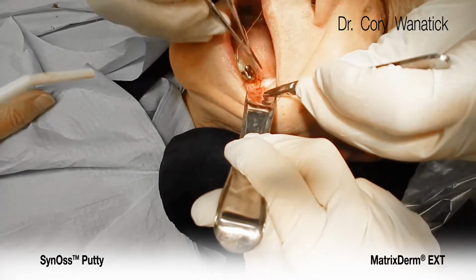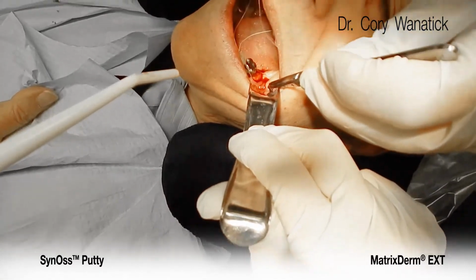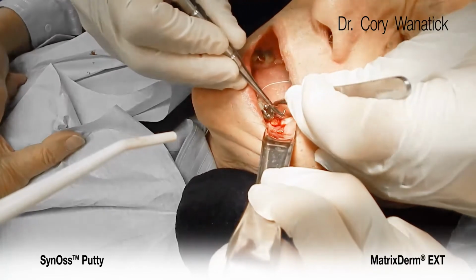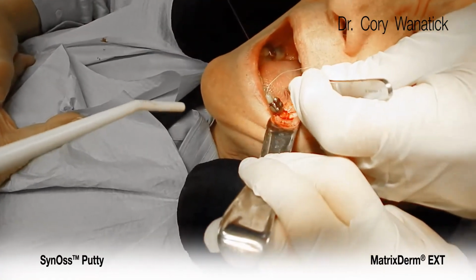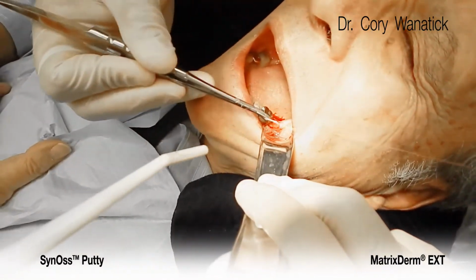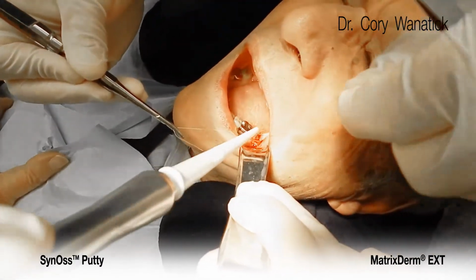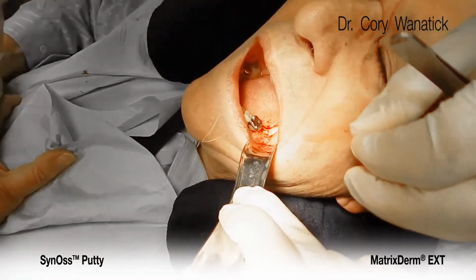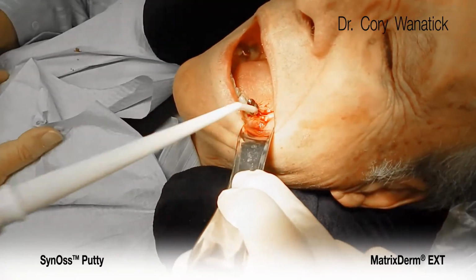I'm going to come through the facial. And we'll place another, pass the suture through the lingual. Now tie it off. And we'll place one more suture on the distal aspect.